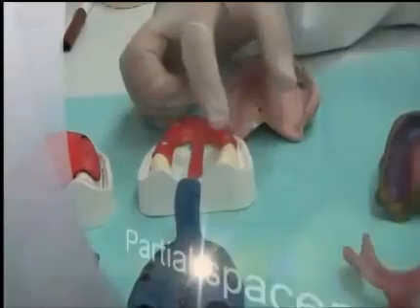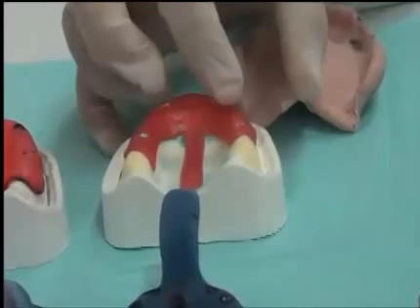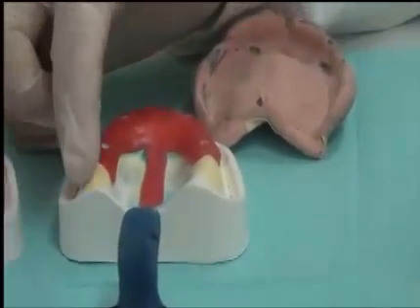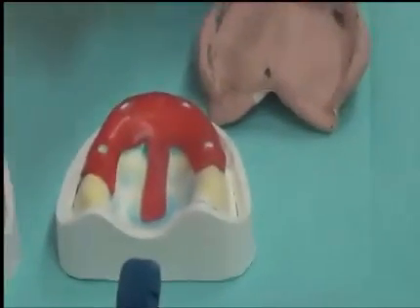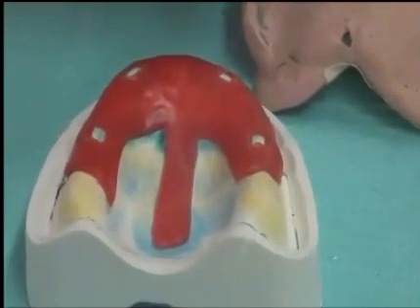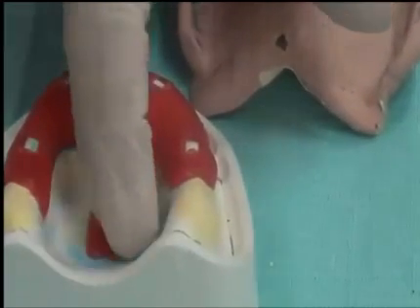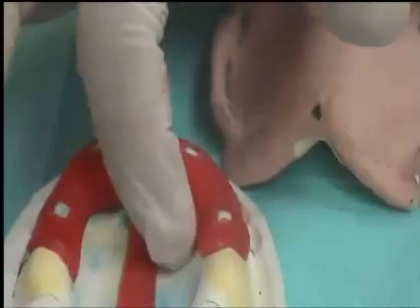What about partial spacer? Partial spacer means that I'm placing the spacer in areas we call relief areas that we should not exert pressure on for many reasons. While in the areas without any spacer, we have the tray closely fit to the tissue. So in these areas, the impression material will be squeezed between the impression surface of the soft tissue and the tray. So this area will be firmly compressed. These areas are firmly compressed, and these are called support areas.